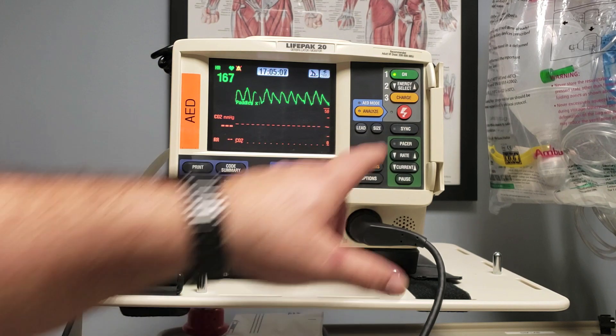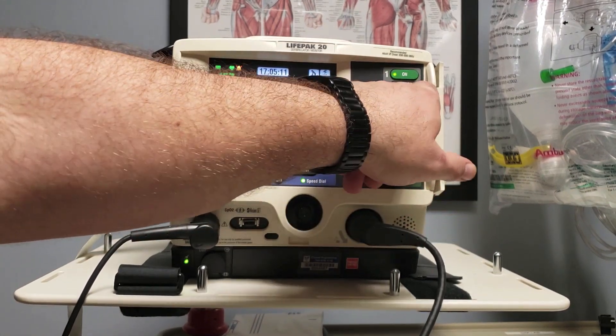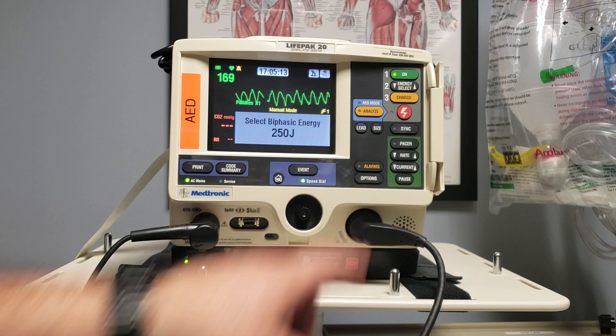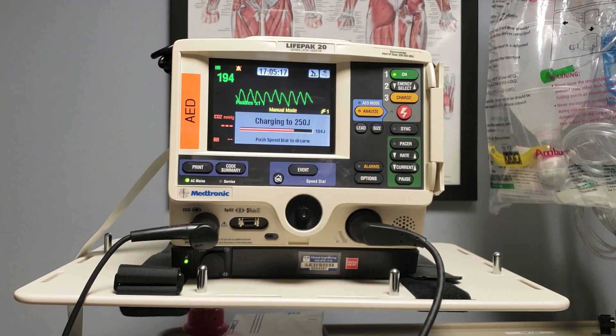If there is the decision to increase energy, all you need to do is hit this energy select until you've gotten to the point you want to go. Then once you hit charge, you'll see again the prescribed dose is ready to go. Hit charge — 'I'm clear, you're clear, we're all clear' — and deliver that shock.